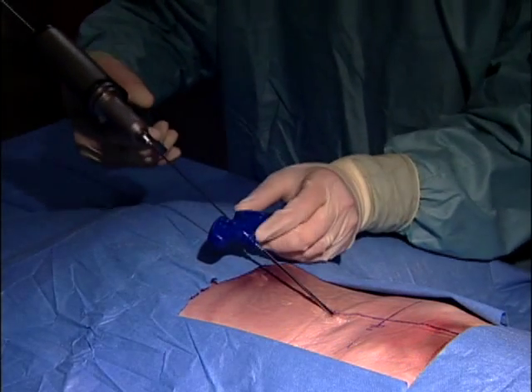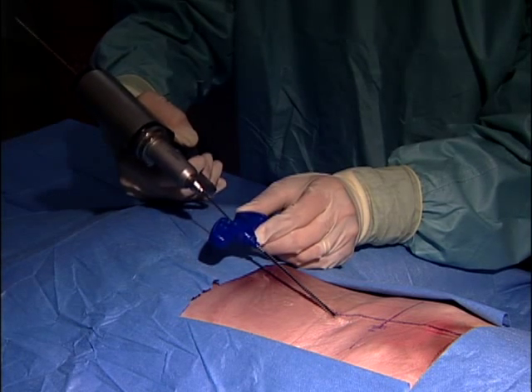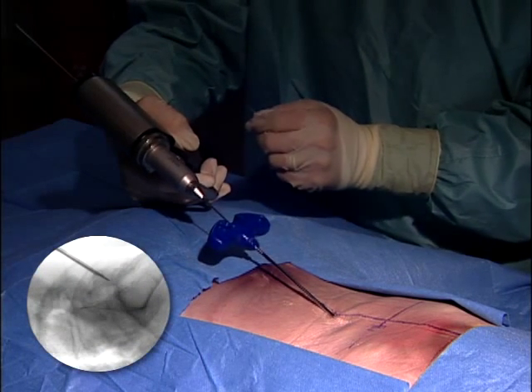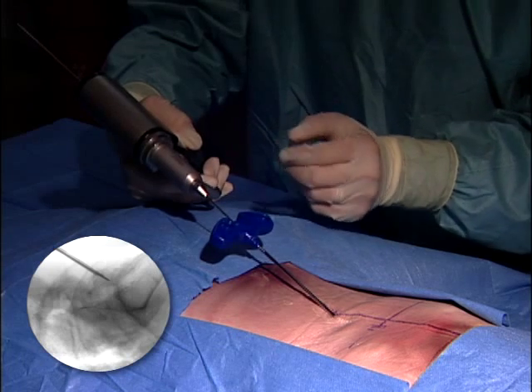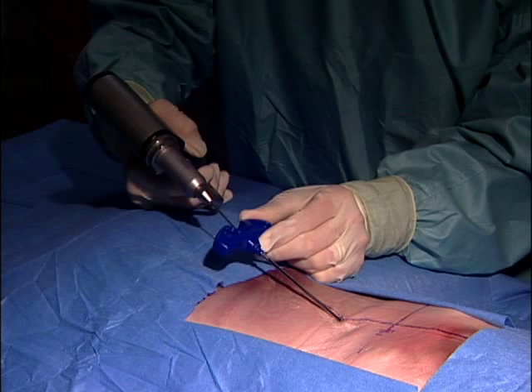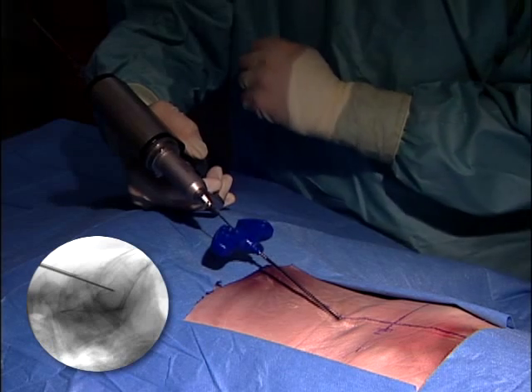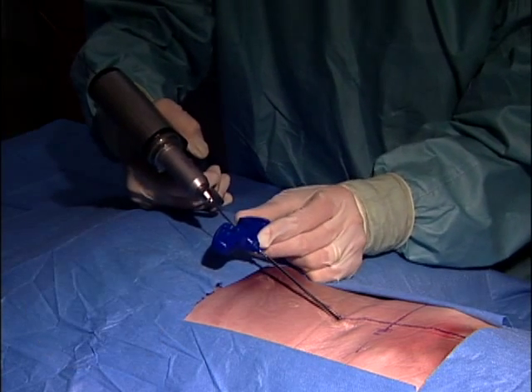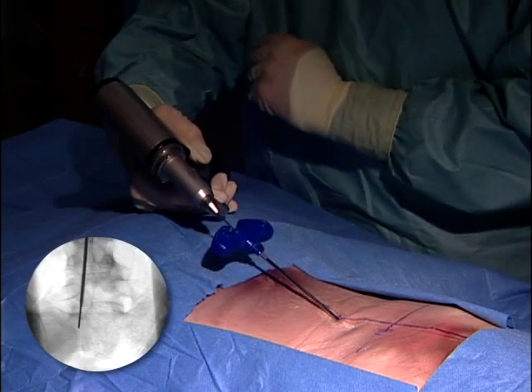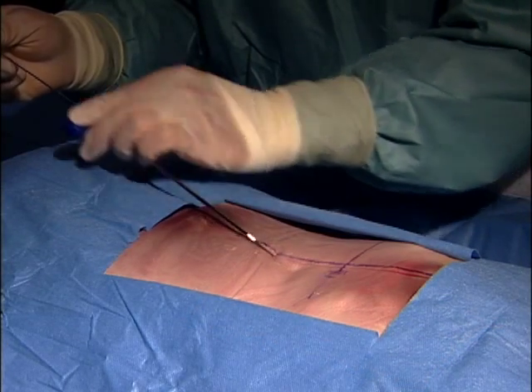With the inner stylet removed, the .062 K-wire is passed through the access needle and driven across the facet joint through the center of the pedicle to the mid-portion of the anterior vertebral body. This should be accompanied by a series of fluoroscopy images to ensure the K-wire tip reaches the appropriate position and that the trajectory does not change as the wire goes across the facet joint into the center of the pedicle. To assure precise wire placement, confirmation should be made through an AP fluoroscopy view. The access needle is then removed while maintaining wire placement.